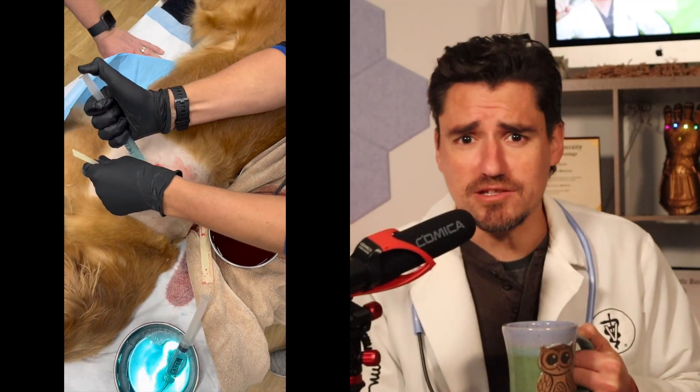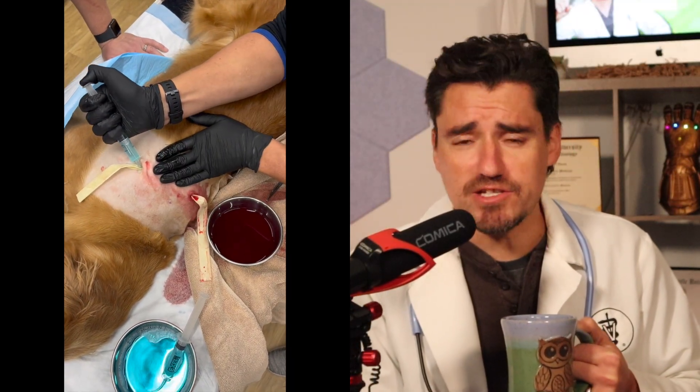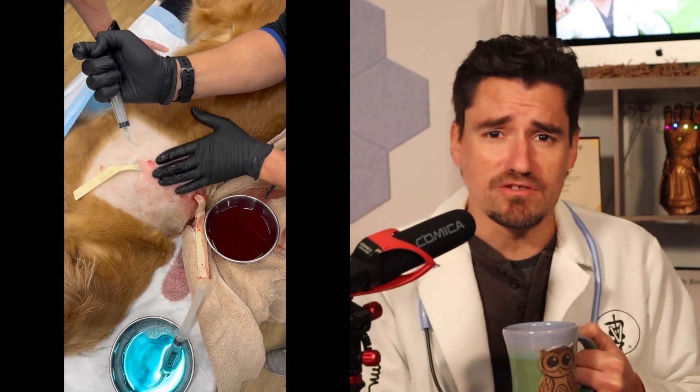This blue solution is chlorhexidine solution. We're going to use this to flush and irrigate the infection and wash away any additional infection.